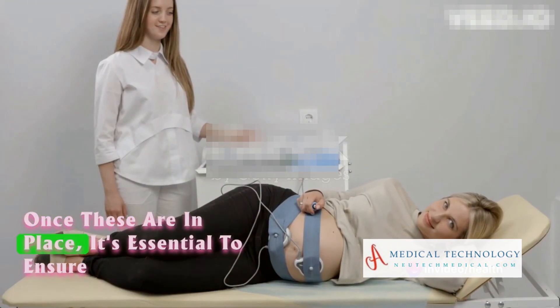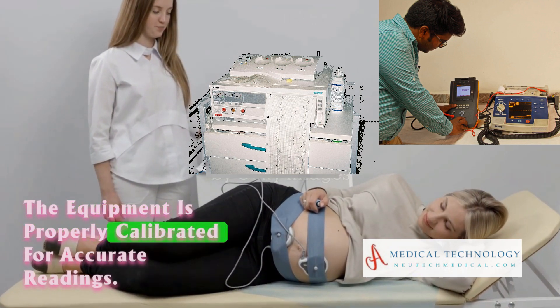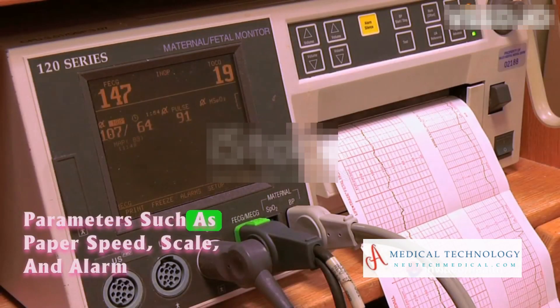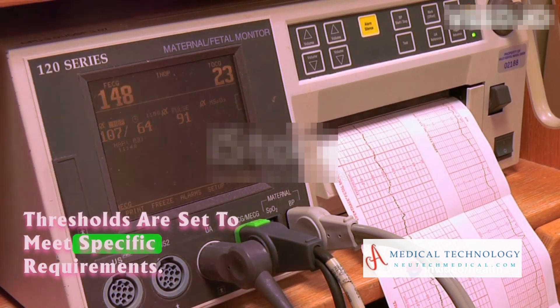Once these are in place, it's essential to ensure the equipment is properly calibrated for accurate readings. Next, the monitor is powered on and settings are adjusted. Parameters such as paper speed, scale, and alarm thresholds are set to meet specific requirements.